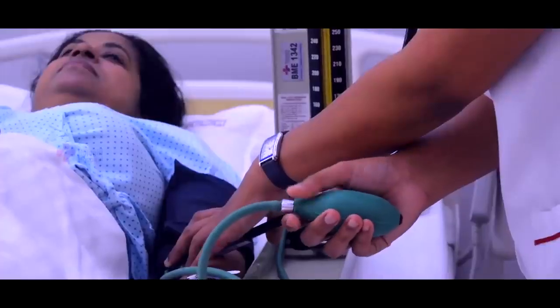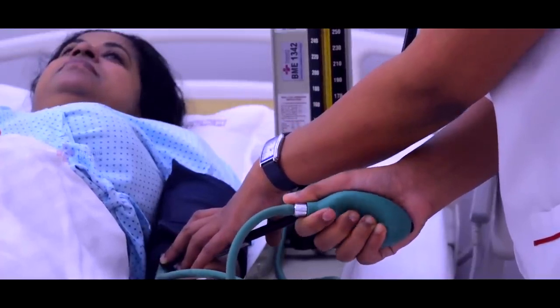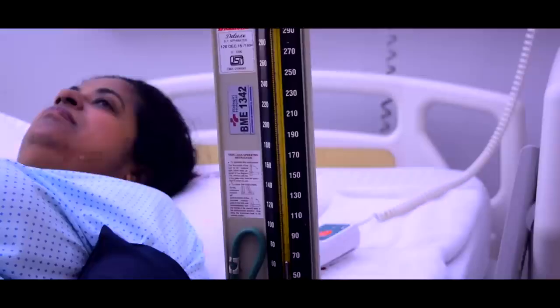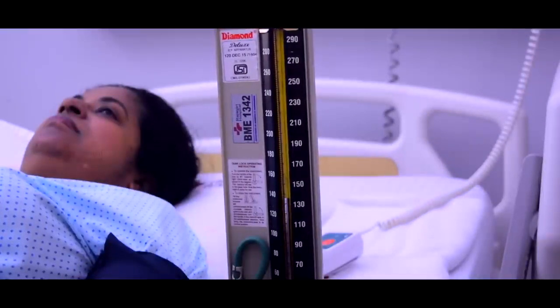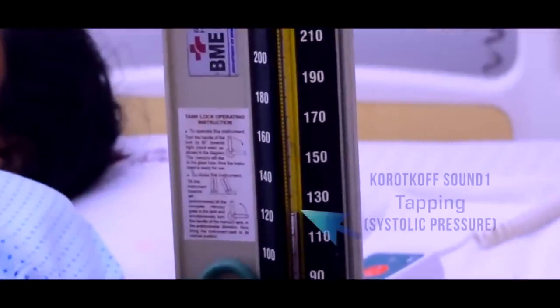Pump the cuff until you no longer feel the brachial pulse. Auscultate the client's blood pressure. Pump the cuff until the sphygmomanometer reads 30 mm of Hg above the point where the brachial pulse disappeared. Release the valve of the cuff carefully so that the pressure decreases at the rate of 2 to 3 mm of Hg per second.